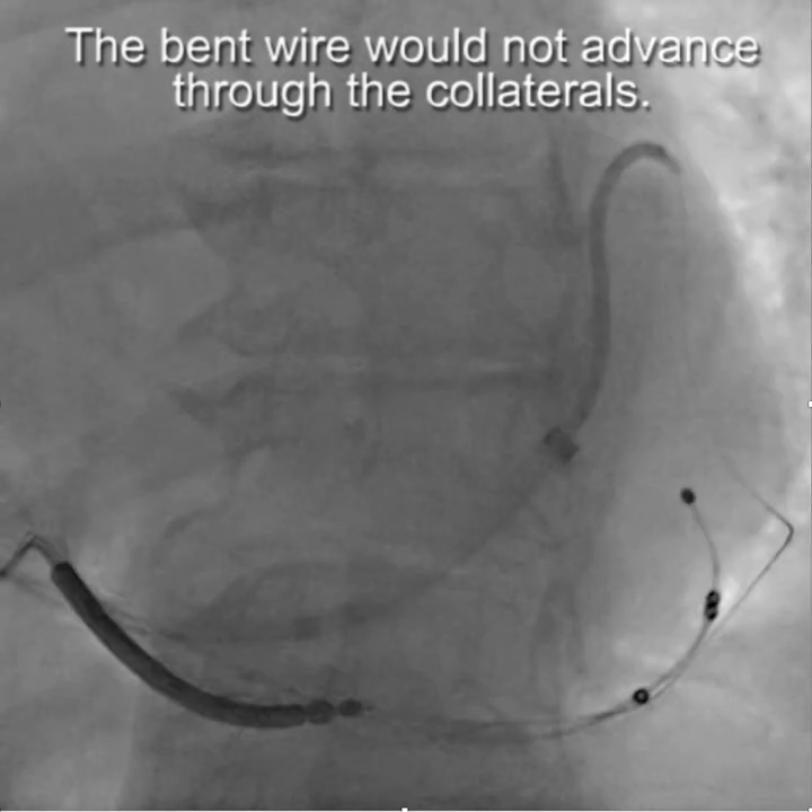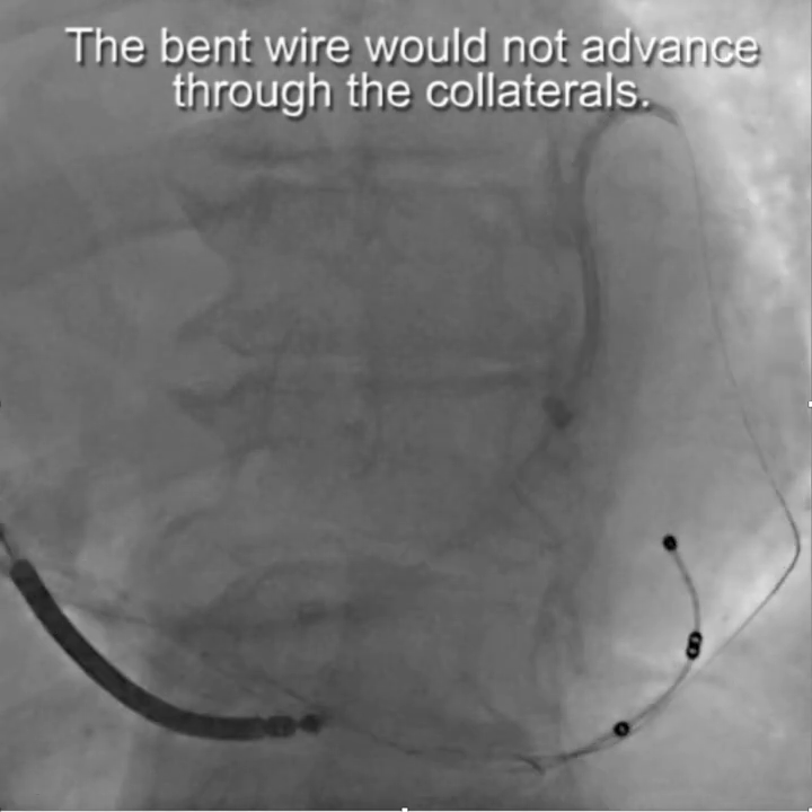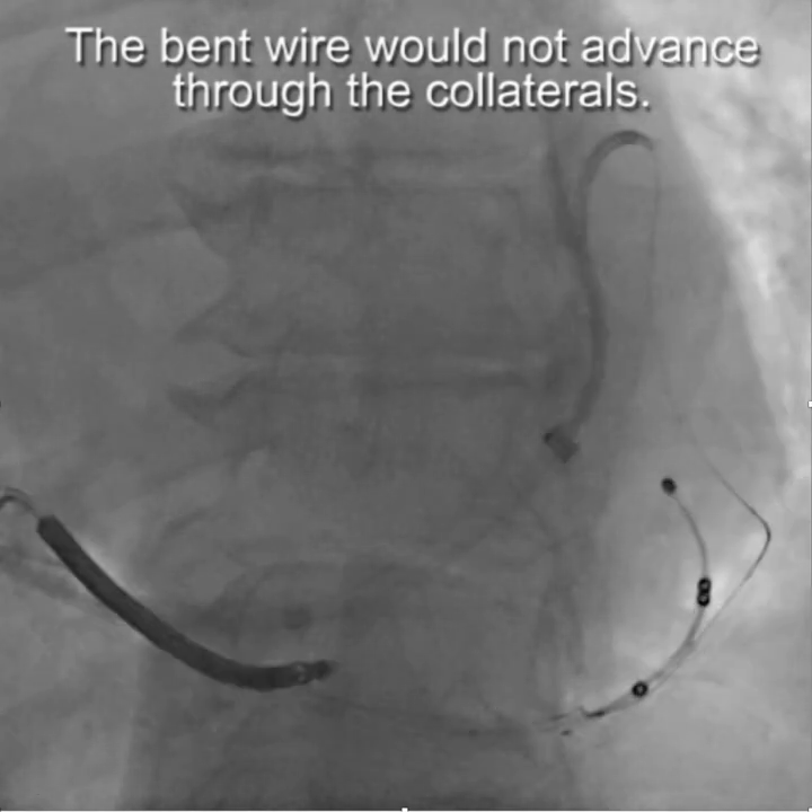So if you get this far, you don't want to lose ground. I'm pushing the wire here, trying to get it to go out into the coronary sinus, but it won't go.